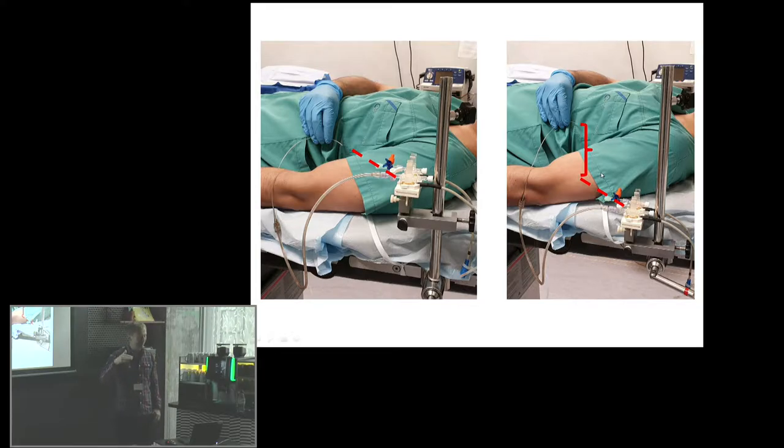So that makes a difference, particularly if you want to measure the left atrial pressure, which is of clinical interest because it reflects the pressure required to fill the ventricle. If you have heart failure and congestion, so the blood is congested back into the atrium and lungs, this pressure is elevated, and if you have more than 12 or 15 millimeters of mercury in the left atrium, it's considered heart failure. So you can misdiagnose if you don't do this accurately. There are many things you have to be aware of when you do these measurements.